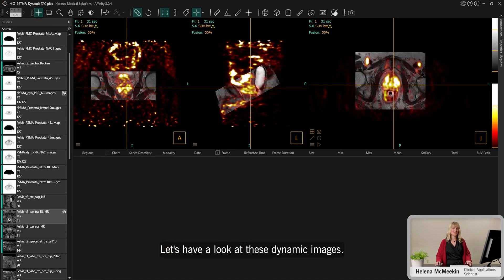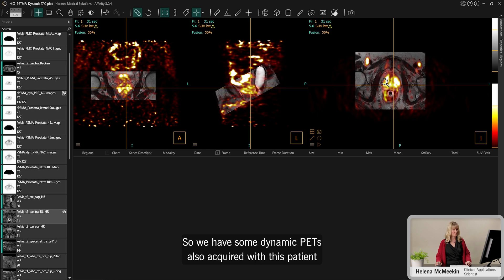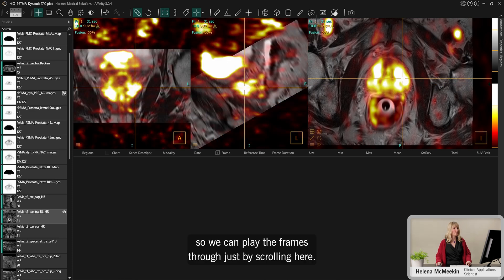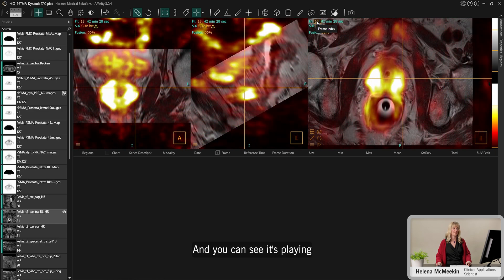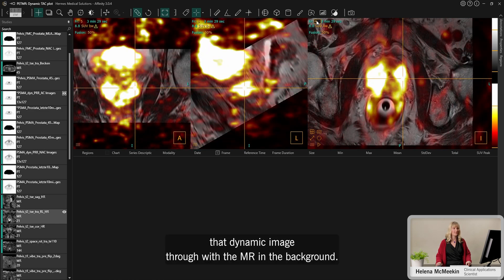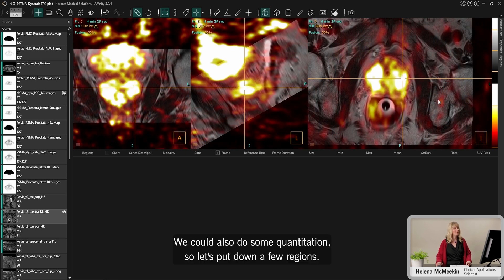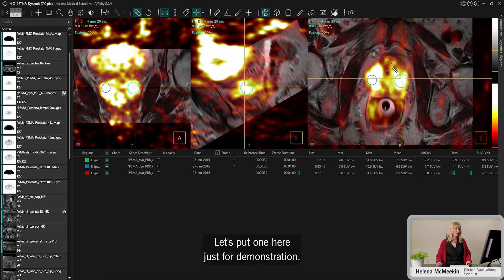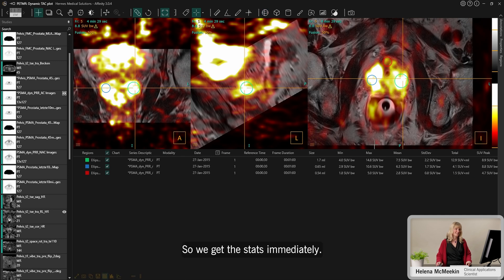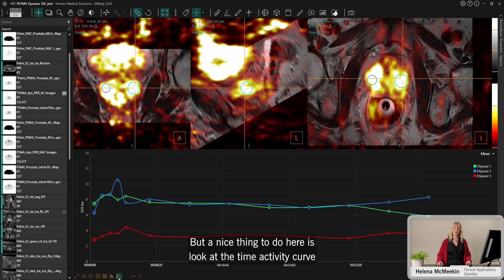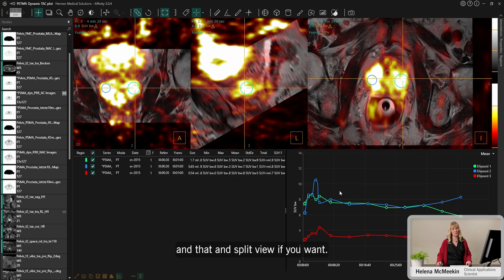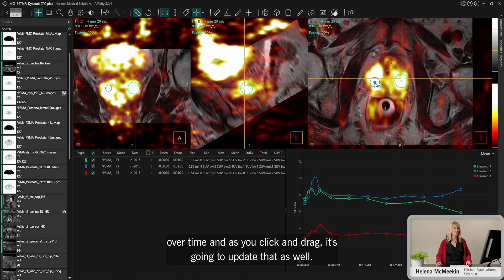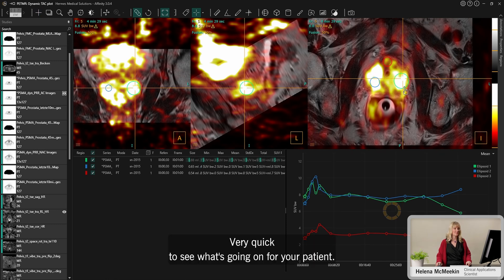We also have dynamic PET images acquired with this patient. Scrolling through the frames plays the dynamic image through with the MR in the background. For quantitation, I place ellipsoid regions on a couple of areas — you get stats immediately — and then view the time activity curve in a split view, showing the change in those regions over time. Clicking and dragging updates the curve in real time.